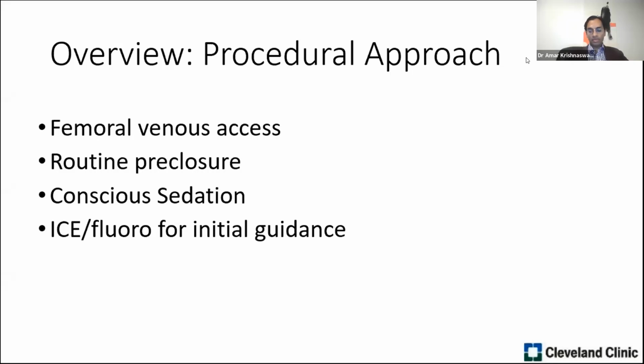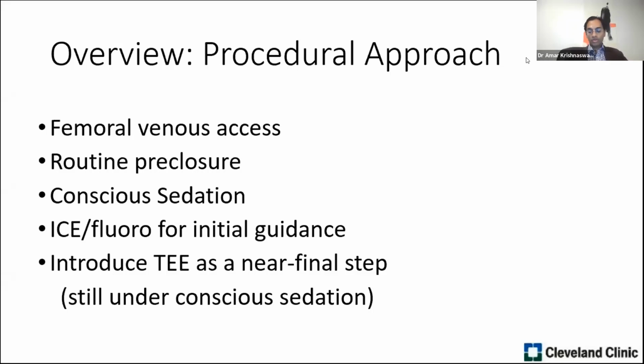Because we have planned the procedure based on the pre-procedural echoes, we were able to direct ourselves fluoroscopically to the location of the leak. And then once we've introduced a couple of plugs, we'll have our imaging colleagues place the TEE to understand if we need to implant more devices or if we're done with our procedure. They, of course, are accomplished in doing this under conscious sedation, so we're able to avoid the anesthesia team and intubation and so forth.